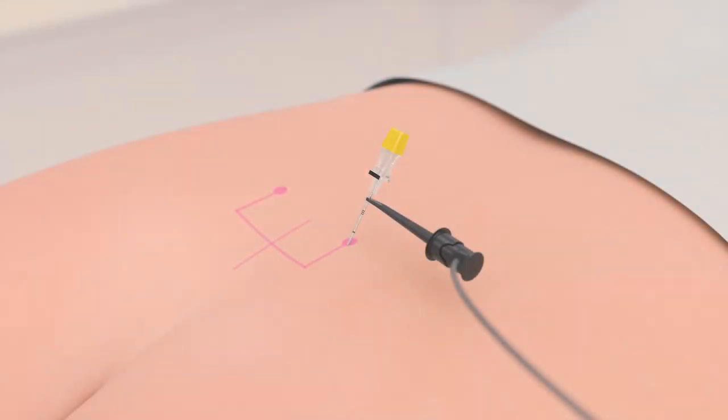After an initial response is obtained, the needle should be advanced a half a centimeter and tested again. This is repeated for a total of 2 centimeters or until the response is lost. Then the needle is retracted slightly until response is evident again.